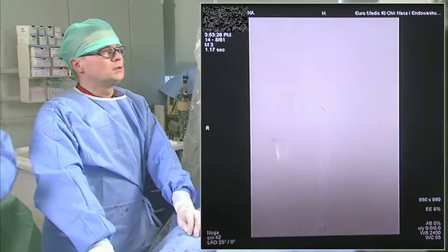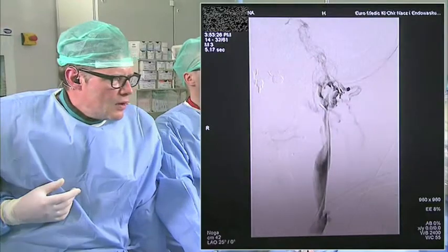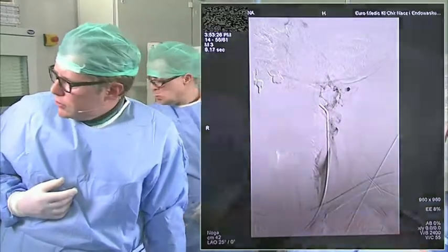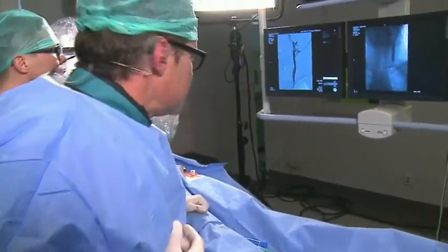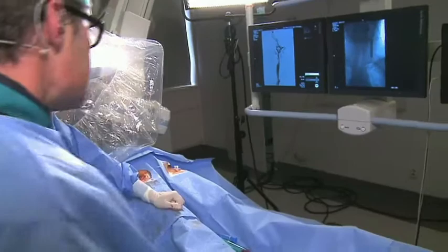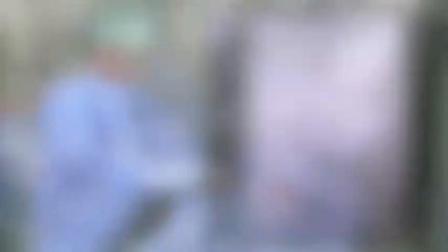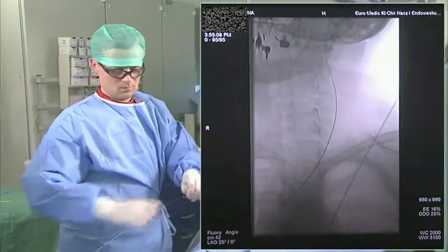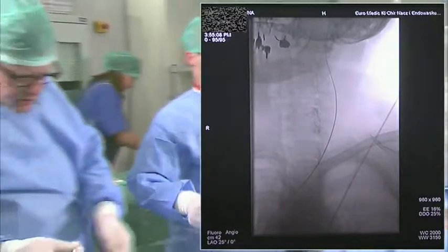I think we have to improve the outflow of the lower part of his vein. Maybe we'll take a bigger balloon — a 14mm balloon — with longer inflation. Yes, we have a 14mm balloon now.